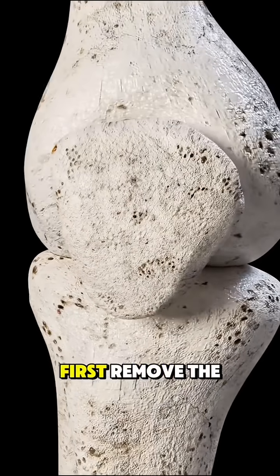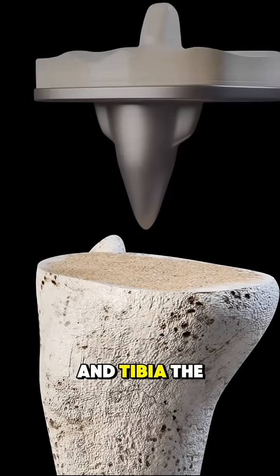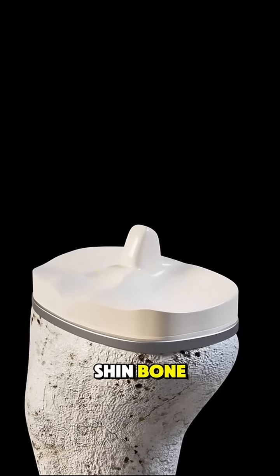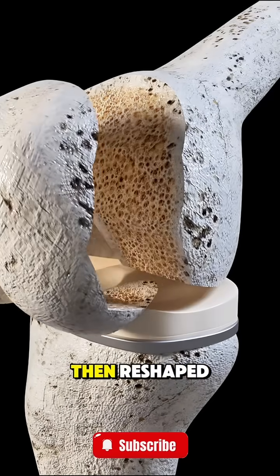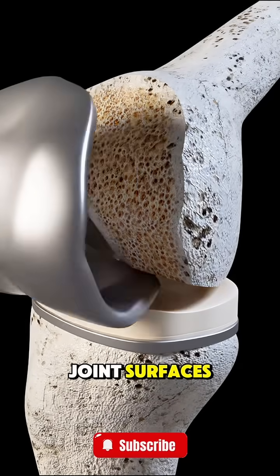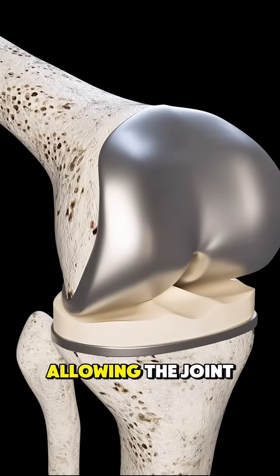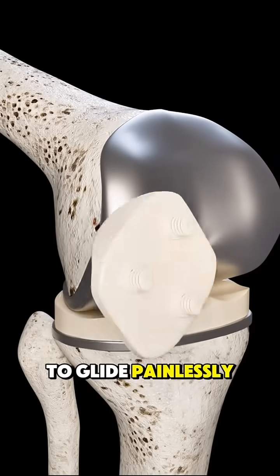During surgery, doctors first remove the damaged cartilage and bone from the ends of the femur and tibia — the thigh bone and shin bone. These surfaces are then reshaped and metal implants are placed to act like new joint surfaces. A smooth plastic spacer is inserted between them, allowing the joint to glide painlessly.